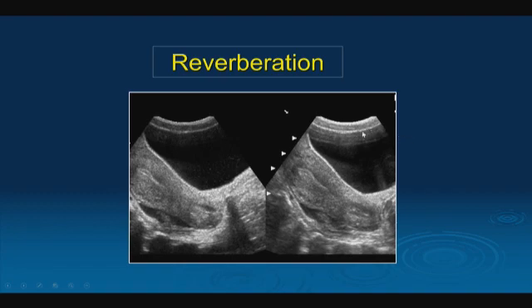So when we initially start scanning, we see this. The near field of the bladder is completely filled in with these lines, these concentric lines that are equidistant all the way across the field of view. Okay, so that's a reverberation artifact, and we're just seeing the echo because as it travels quickly through a fluid-filled structure, every time it makes that round-trip travel time, it plots a line.